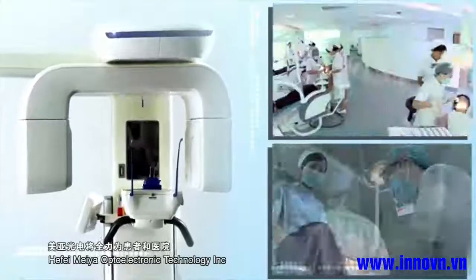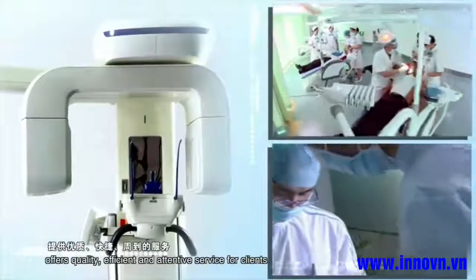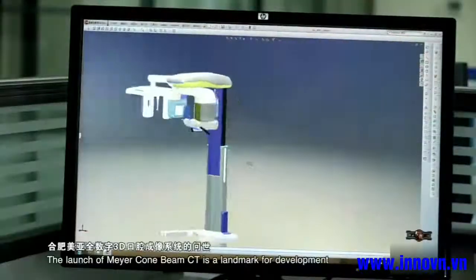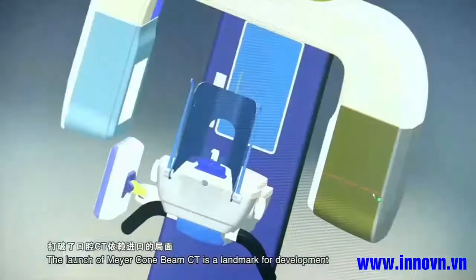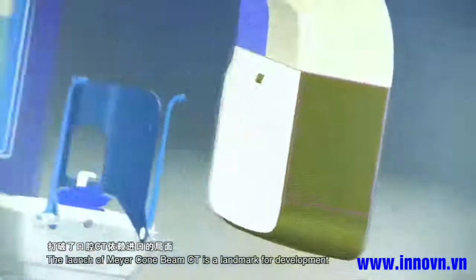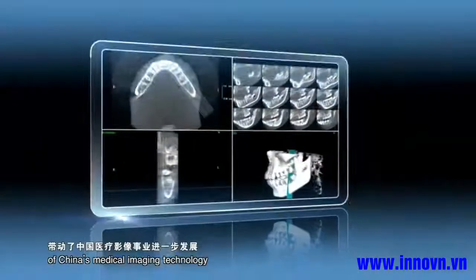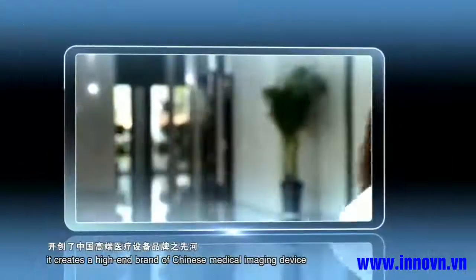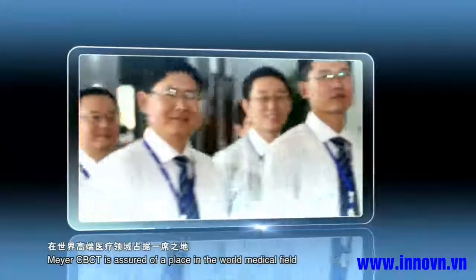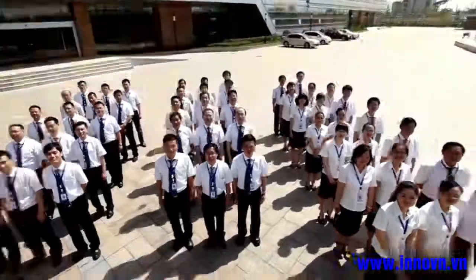Meyer Optoelectronic Technology Incorporated offers quality, efficient, and attentive service for clients. The launch of Meyer Cone Beam CT is a landmark for the development of China's medical imaging technology. It creates a high-end brand of Chinese medical imaging devices. Meyer CBCT is assured of a place in the world medical field.